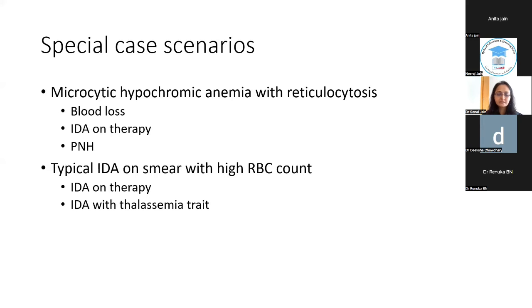And since we discussed an iron patient on therapy, I would also like to highlight one which we have commonly seen in practice: a patient with 11 hemoglobin and RBC count of 6 million. You look at the peripheral smear, there's standard iron deficiency with a moderate poikilocytosis, no nucleated RBCs, high RDW. Iron deficiency prima facie has low erythropoiesis, low red cell count. But when you give iron to them, then hematopoiesis accelerates and it overshoots the normal. So if you see them for the first time, you will feel that this could be a thalassemia trait or hemoglobinopathy.